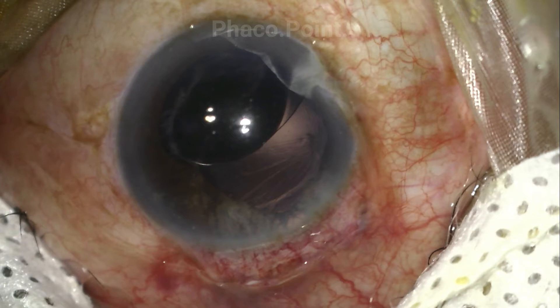A UBM performed in the postoperative period showed the presence of a zonular dialysis between the 6 and 9 o'clock positions — that is, 3 clock hours of zonular dialysis. There was also a posterior capsular rupture which had been missed in this case.